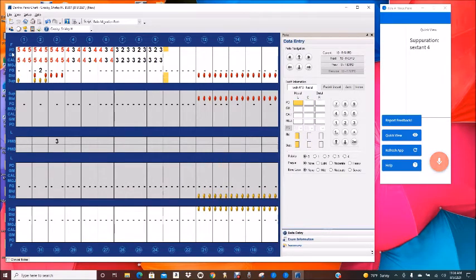Start recession. 333, 222, 111. Jump to tooth number 7. 0, 1, 0. 0 plus 1, 0. Start pocket depths. 3, 2, 3, 10, 11, 12, 3, 2, 3.